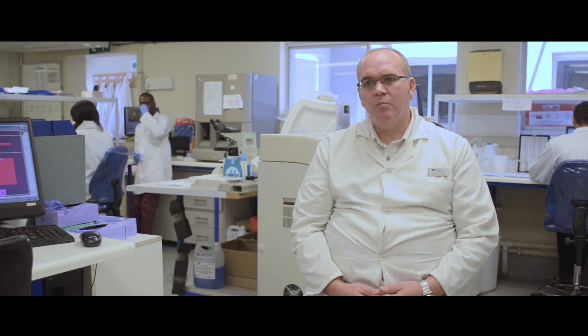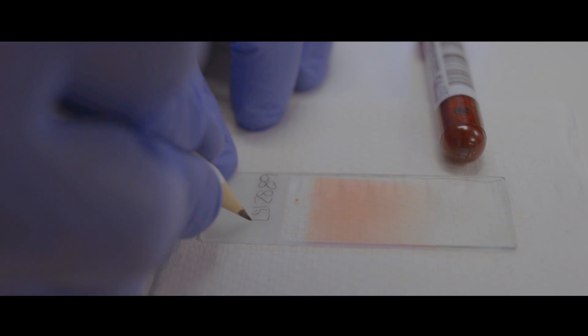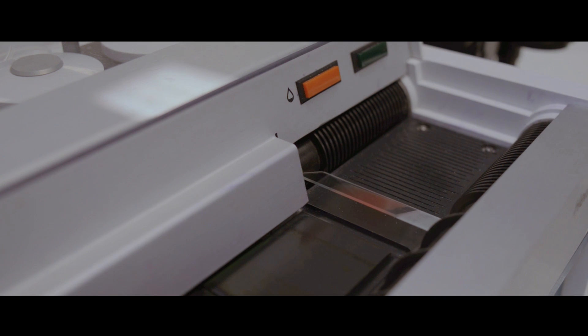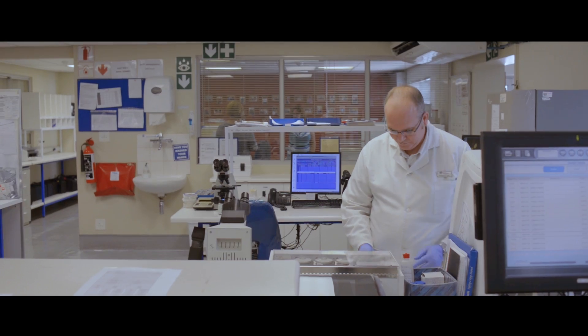In some scenarios the instrument might show us that there may be parts of the blood that we need to have a closer look at, and that is when we make the blood smear. The blood smear can't just be put under the microscope as is, so we have to give the cells a colour so that we can distinguish which cells are which. We put it through the staining process.